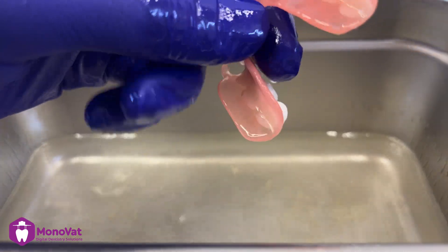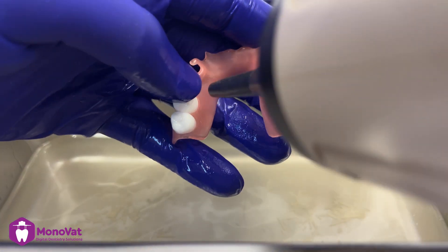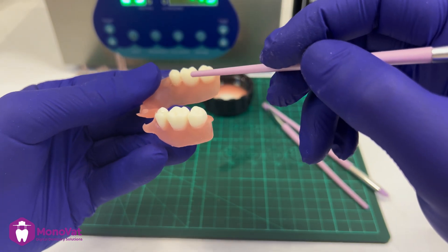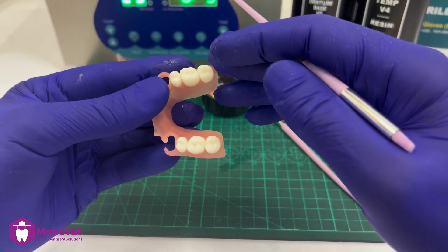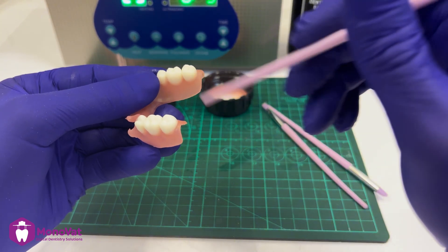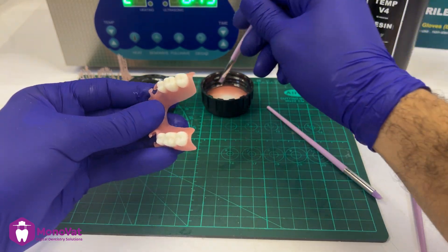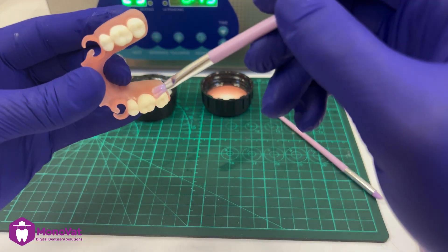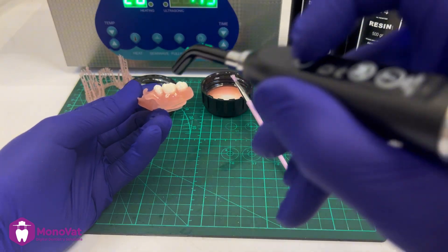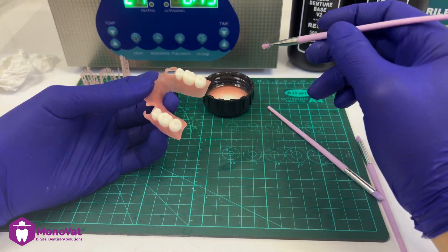After finishing, wash the denture again to remove dust and dry it well. Then check all the gaps between the teeth and the denture — they should all be filled with resin and fully closed. If not, food will get inside, so seal it very well with the same resin and cure it.